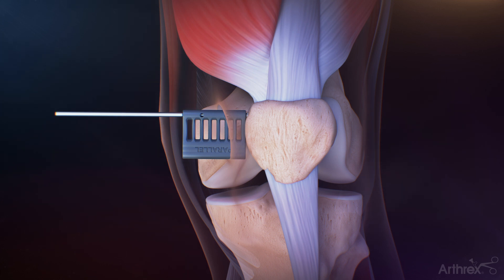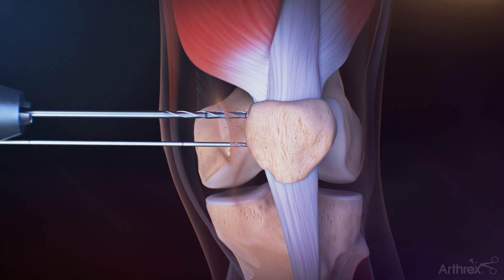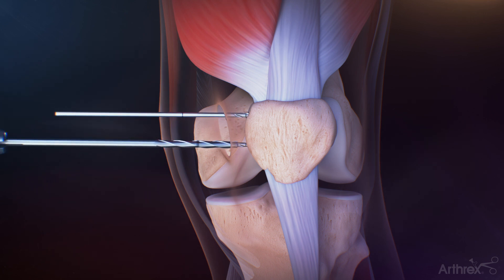If using the parallel guide, drill the 2.4 mm guide pin to the second laser etch mark off the parallel guide. The longer guide pin is placed 15–20 mm distal and parallel to the first guide pin using the parallel guide. The parallel guide is removed and both 2.4 mm guide pins are overdrilled with a 4.0 mm cannulated reamer to the laser etch line.